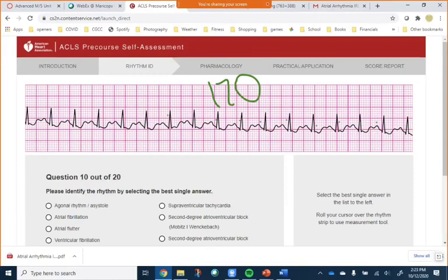All right. For me, I'd stop here. Greater than 150, that counts as SVT as far as I'm concerned, unless it's got a wide, weird QRS. Does it have a wide, weird QRS? Nope, it's got a normal narrow, it's one box.